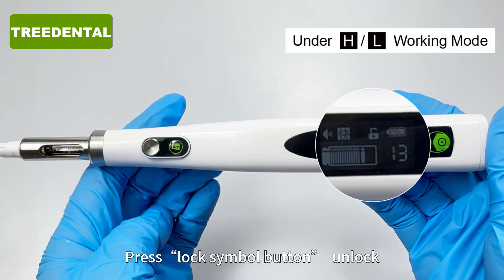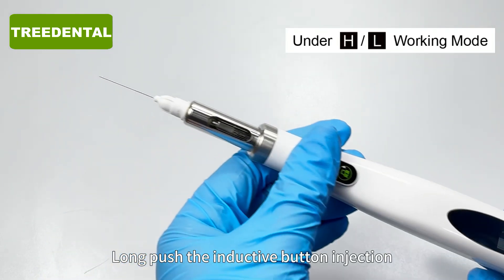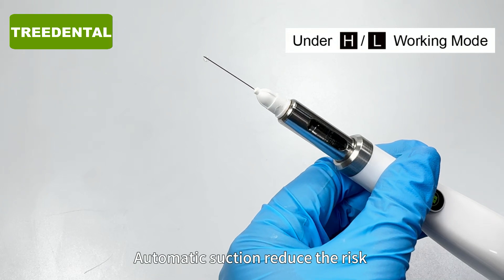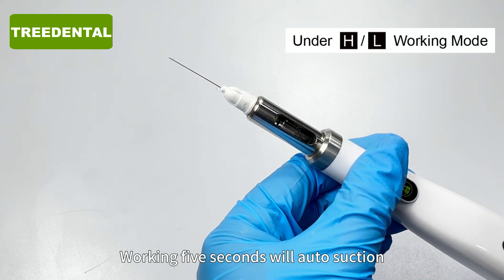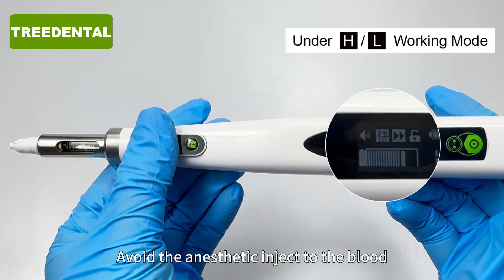Press the lock symbol button to unlock. Long push the inductive button to start injection. Automatic suction reduces the risk — working 5 seconds will auto-suction to avoid the anesthetic being injected into the blood.